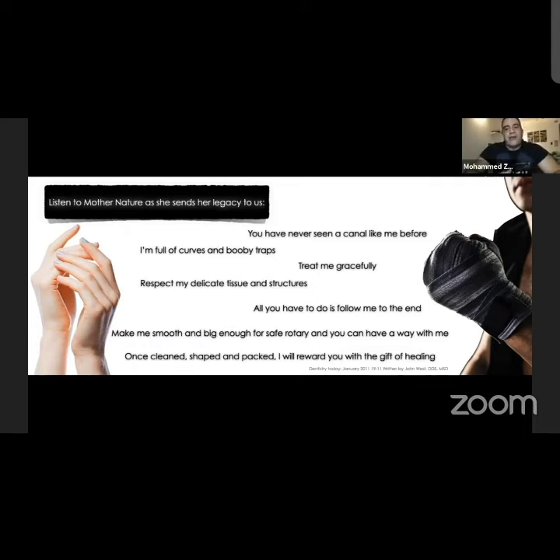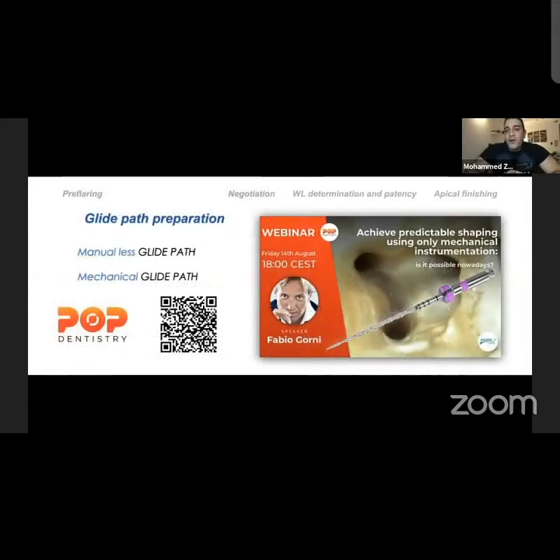I know some clinicians like to skip this manual glide path and go directly for rotary instrumentation or rotary glide path preparation. According to literature, more than 90%, maybe 95%, and also according to clinical practice, we can do that. But from my point of view, speaking about safety, a clinician can decide or determine which canal he can go by manual file only, or which canal we can go directly by rotary instrumentation.